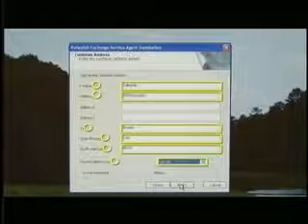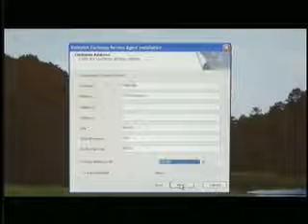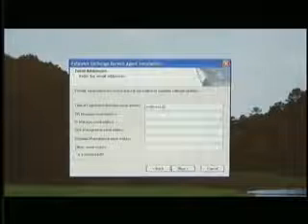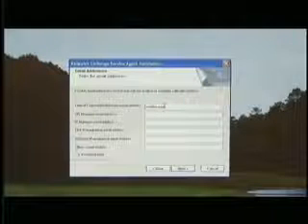Any box on this screen with a red asterisk next to it is mandatory. Warning screens will appear if mandatory information is not entered properly, and you will not be able to proceed. This is hospital name and address information. This next screen is very important. These email addresses will be used to notify your hospital of the availability of Force Triad software updates.